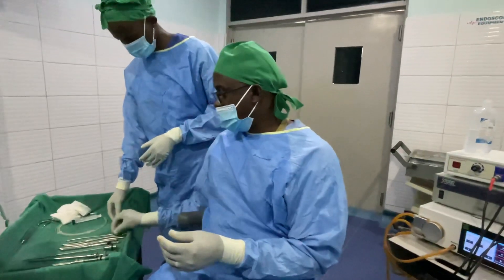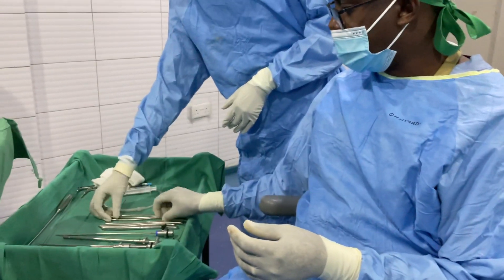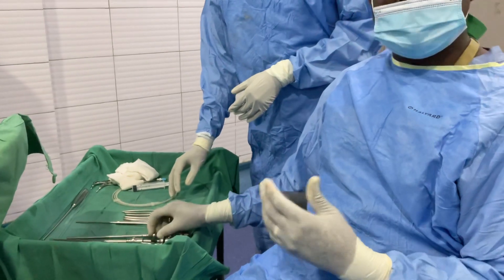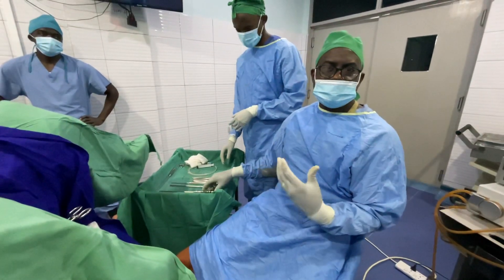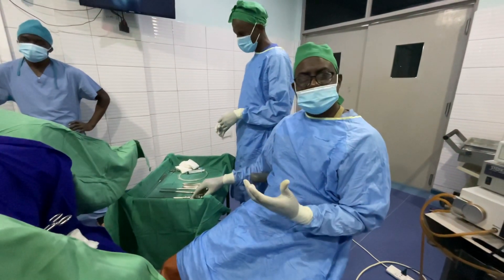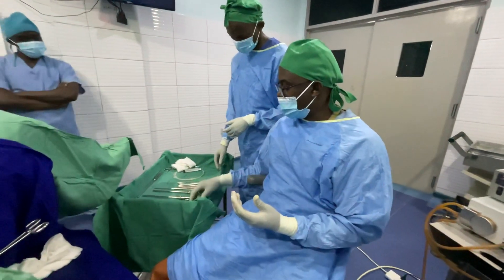You need the Hegar dilators in different sizes from size 4, 6, 7, 8 and up. If you are going to do any operative hysteroscopy or any intervention like removal of foreign bodies, tubal cannulation, removal of myomas, or any sort of resection of endometrium, then you have to use the operating channel.